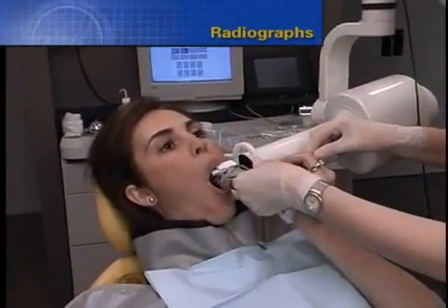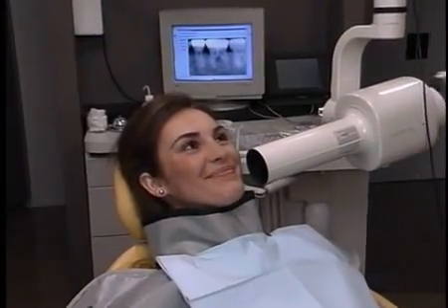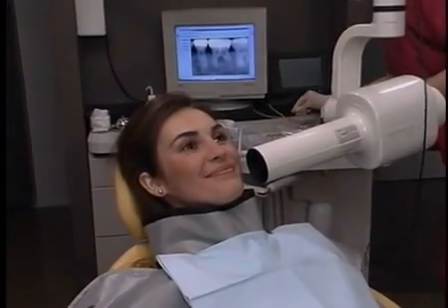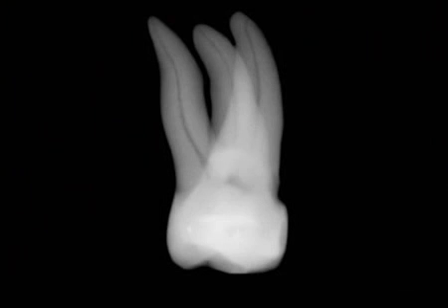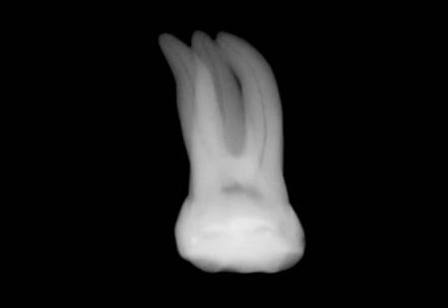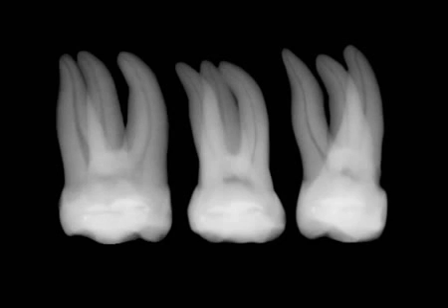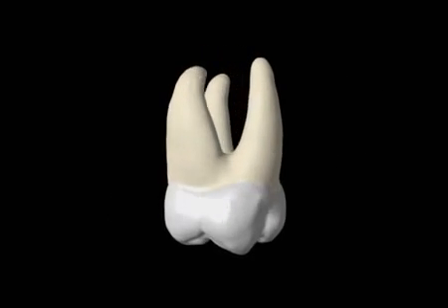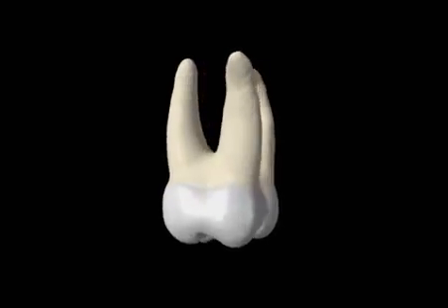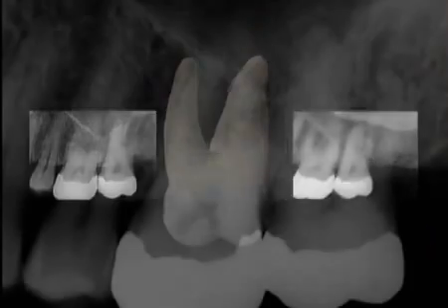Clinicians should take 3 well-angulated radiographs prior to initiating treatment in order to better appreciate the 3-dimensionality of any given tooth. From an endodontic standpoint, preoperative film should include mesial, distal, and straight-on angles. These views will better prepare the clinician for root canal treatment. 3 films, in combination, are more valuable than a single film alone and give us important information as to the buccolingual dimensions of a tooth and root concavities.